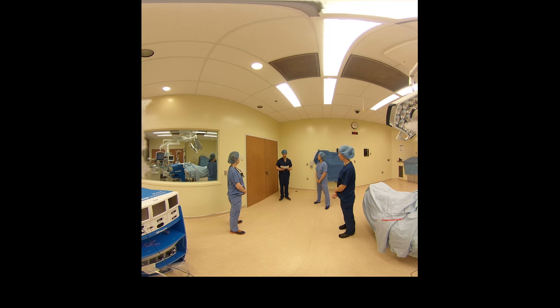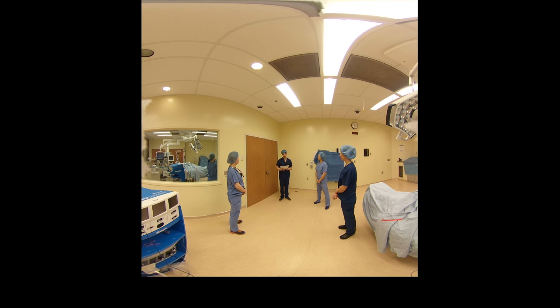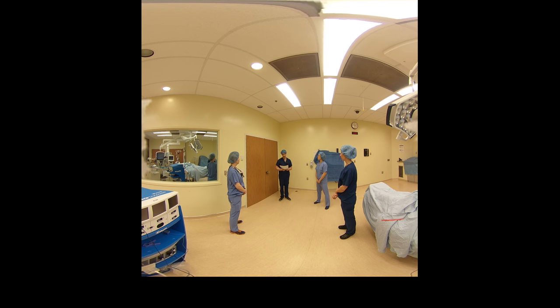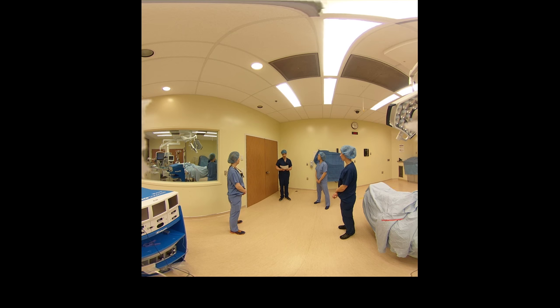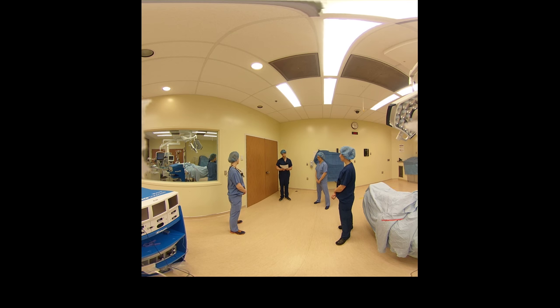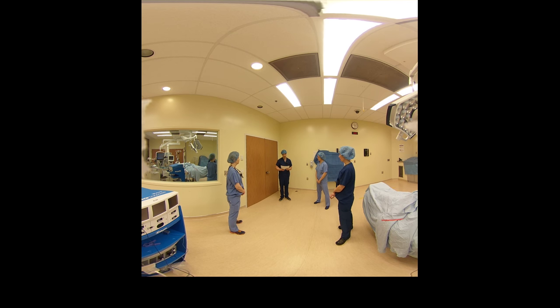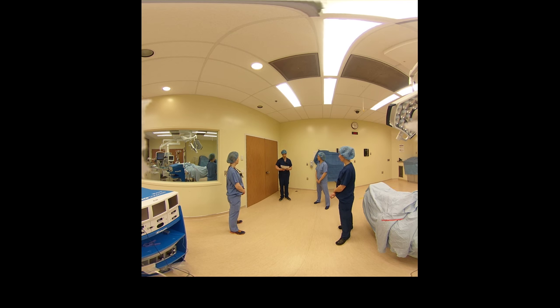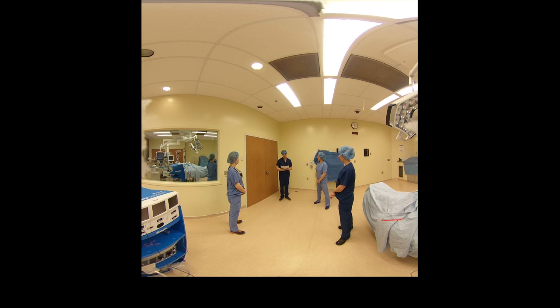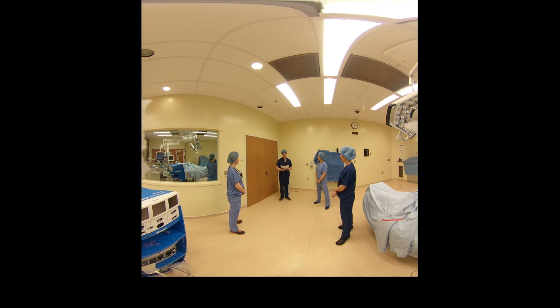We have patient Jane Doe here for a tracheotomy. This is an awake trach on an unintubated patient. The site has been marked — there's no site to mark because it's a midline procedure — and the consent has been verified.